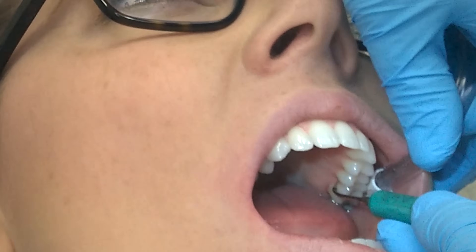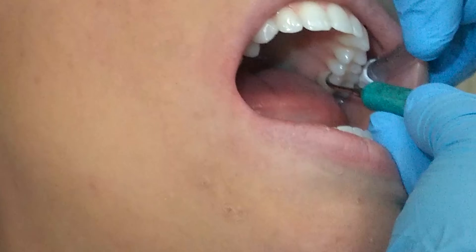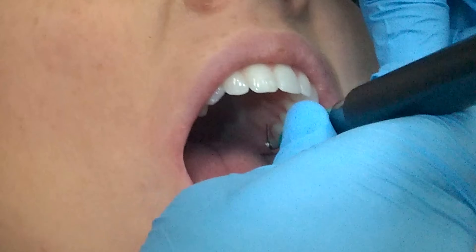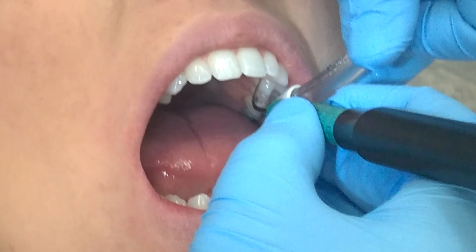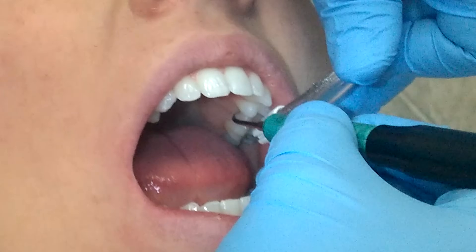Make sure when you use this instrument on a patient that you explain it a little bit first. I usually say something like: 'I'm going to use a special tool that uses a lot of water and vibration to remove some of the plaque and calculus in your mouth today. It makes a unique noise and has a lot of water, but it's the best instrument for your care — just raise your hand if you have any discomfort.'